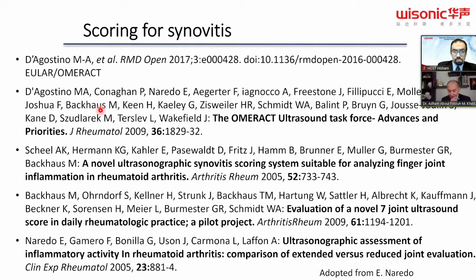And remember, synovitis or synovial hypertrophy can be an element that can be graded. If you include effusion, that's an element. Hypertrophy, that's an element. Erosion, that's an element. If you combine those, you can do a score for one joint. If you combine a few joints, you can include all the elements in one joint and then count the joints and make an overall global score for the patient so that you'll be able to diagnose.